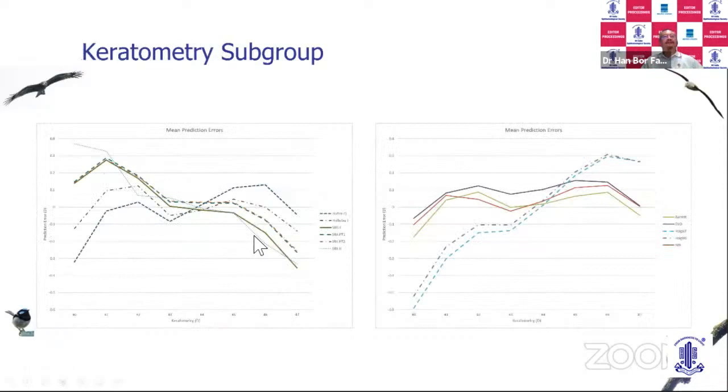What about K? This is based on keratometry, the traditional formula. You can see it's again SRK/T and Haigis as well. Haigis is here, they're sensitive to K. That means their predictability varies with K. Hoffer Q and Holladay are less sensitive to K. And again, the newer formulae, like Barrett, EVO, and RBF, are kind of neutral to K.